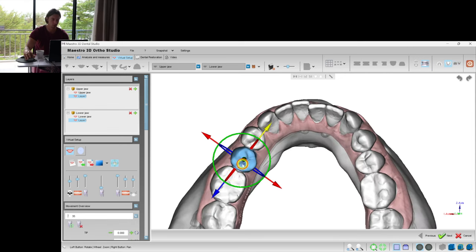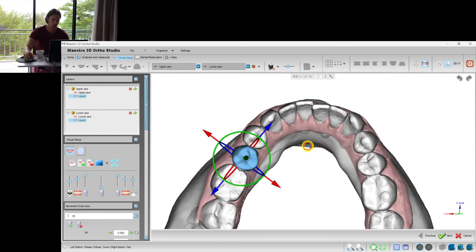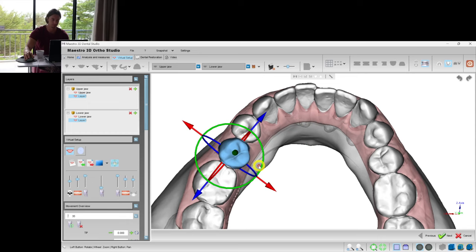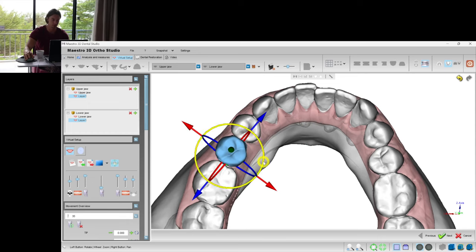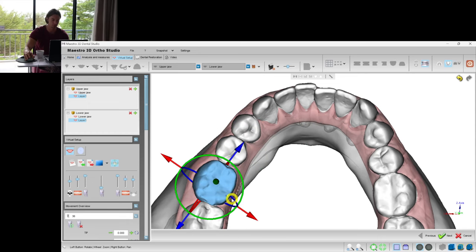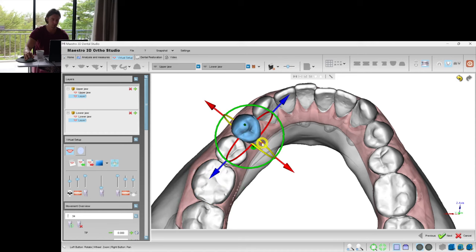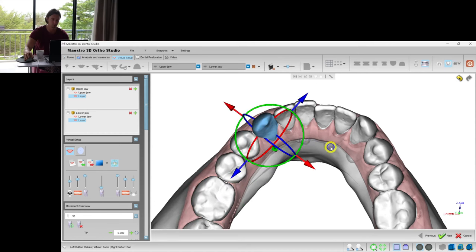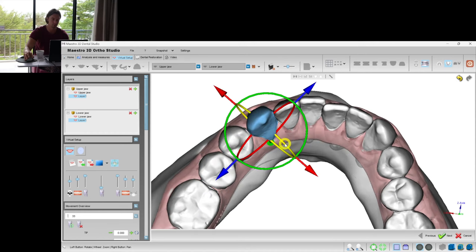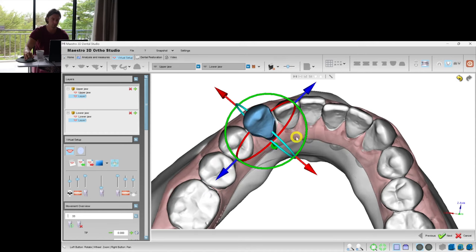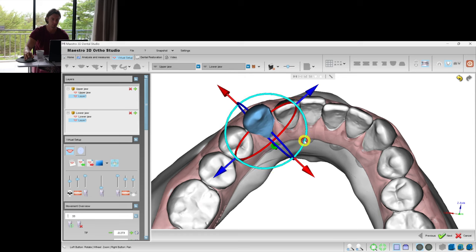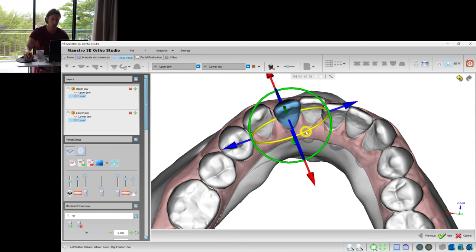So I'll start with some expansion in order to obtain some space in the frontal area of the dental arches.